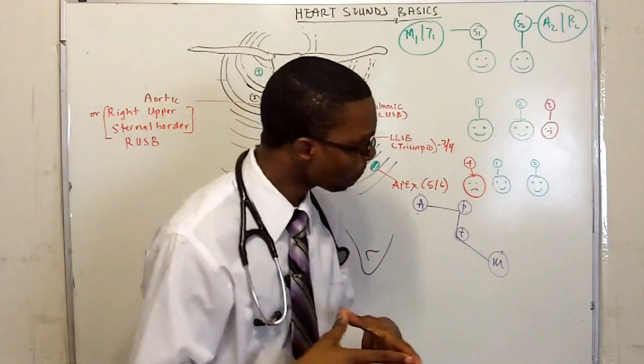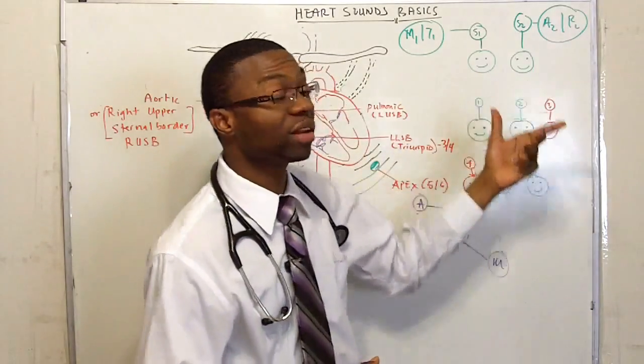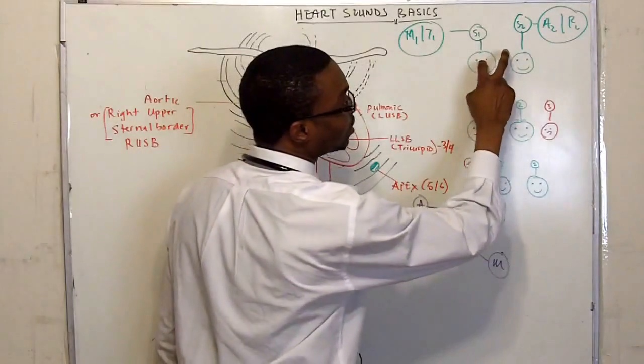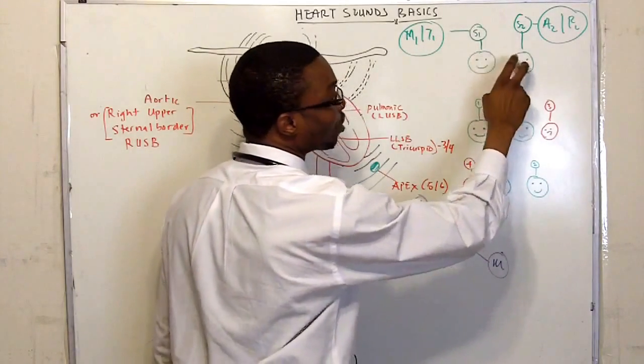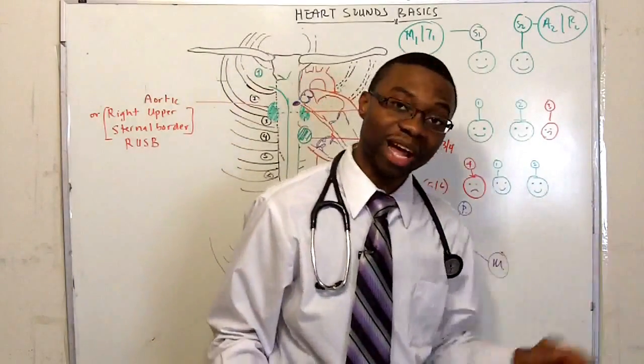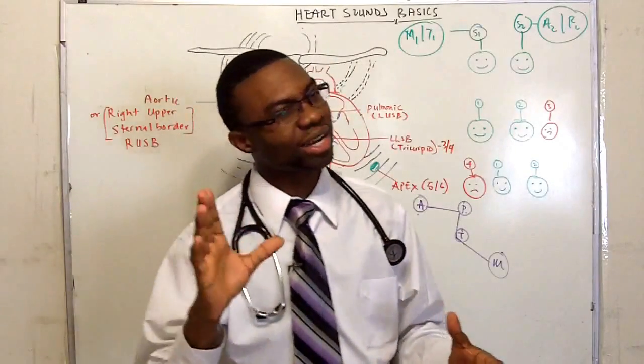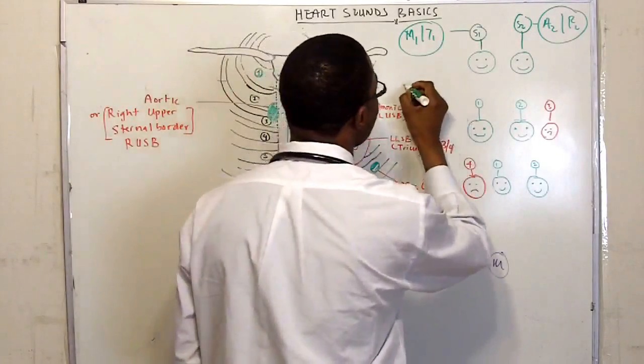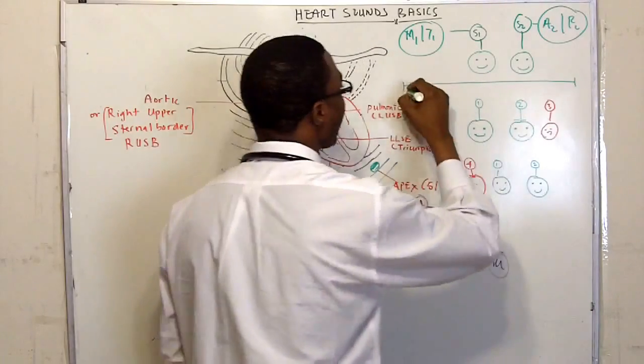Now, if we go down here, now that we have learned how to listen to S1 and S2, remember? 1, 2. 1, 2. Because when I go to another pathology, now you're going to be like, what? I didn't hear that. Okay, we'll find out. So now that we know the normal, this is normal, and everybody's happy.